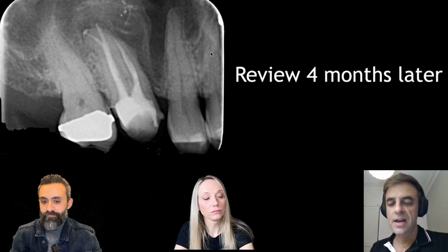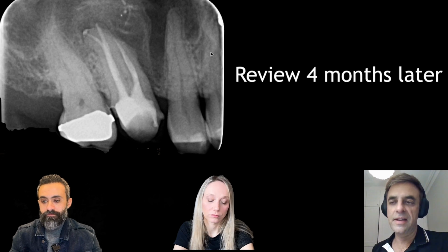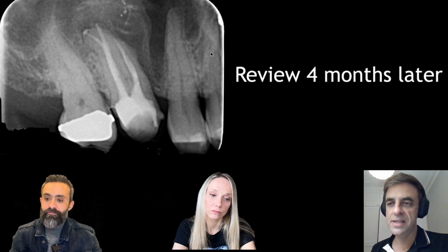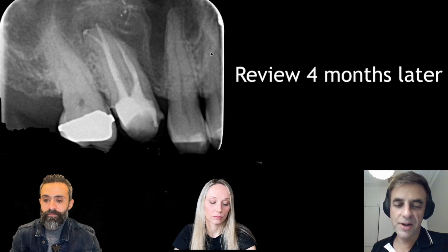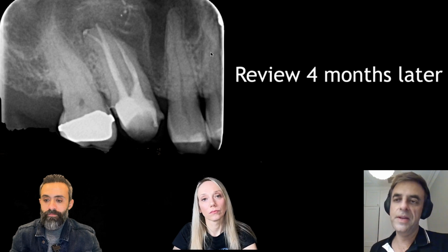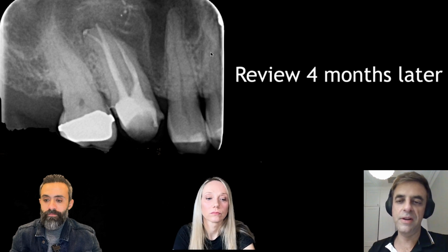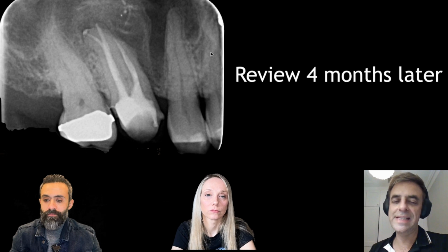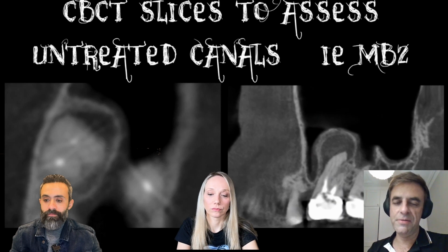So the same for canals. If you want to see an actual root canal, the resolution has to be very good. Obviously, that's one point, and the other point is that the canal has to be quite wide. The same for cracks; it has to be quite wide. So if you're looking at the mesiobuccal root, or a root that you're looking for another canal in, what you're looking for is asymmetry. So it's that Krasner and Rankow study about the symmetry of the root canals.